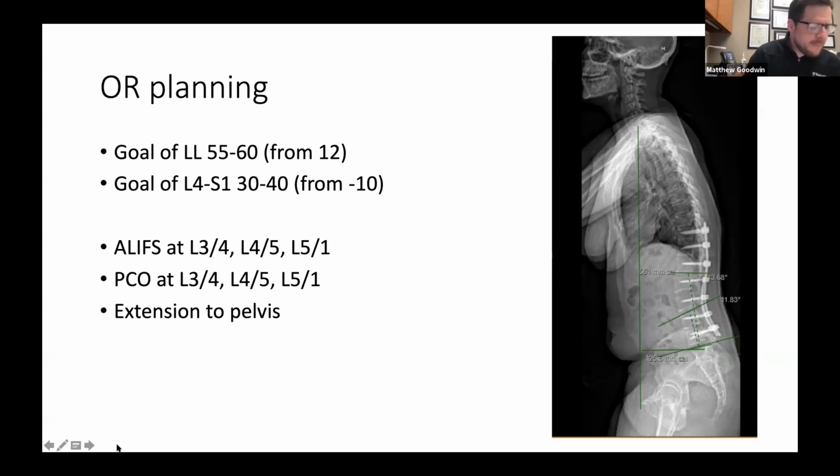Matt, that's a thought. Was she fused at the 9 month mark? Oh, no, sorry. I was just asking if she was arthrodesed on the CT scan at the 9 month mark. So she is, but only through the right side at 3-4 and 4-5, right? Because I took all that bone off the left side and didn't do anything to the disc on the left side. But she has fused through the posterior column on the right.